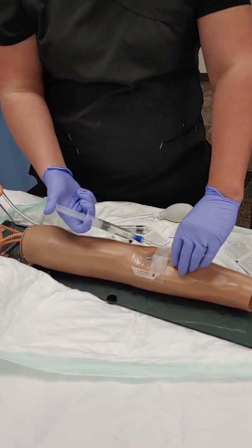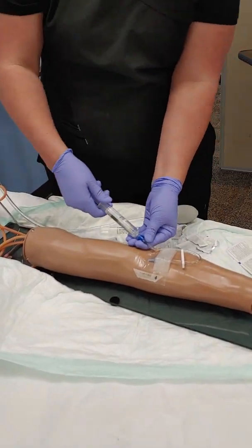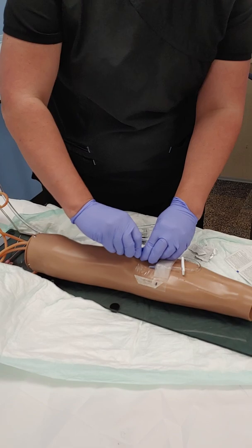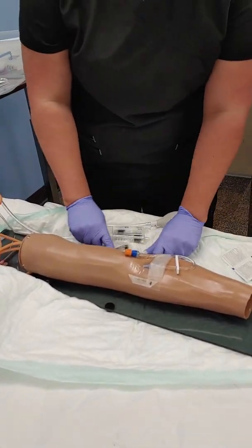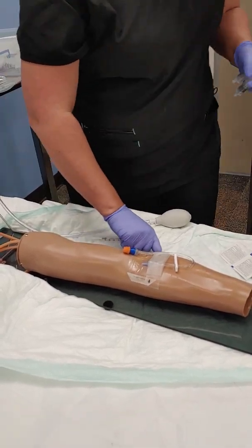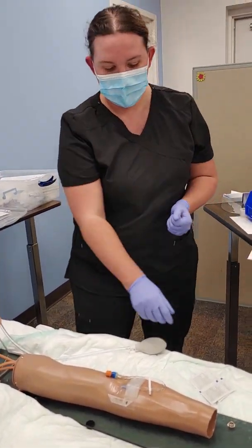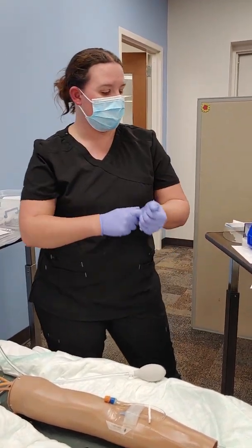We're going to make sure I clamp this tubing when I'm done flushing. Remove syringe, apply disinfection cap. Now I don't have to clean it this time because I'm going to put the self-cleaning disinfectant cap on. Post-procedure, remove gloves, perform hand hygiene, discard equipment, return bed to lowest position, make sure call light within reach, document date, time, dose, route, patient tolerance, and patient education. So I'm going to go ahead and put your bed down. She's got her call light. I'm going to document everything.